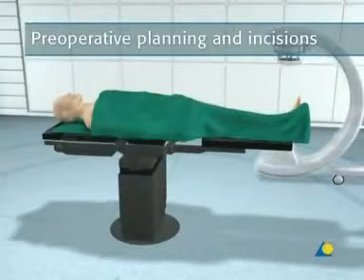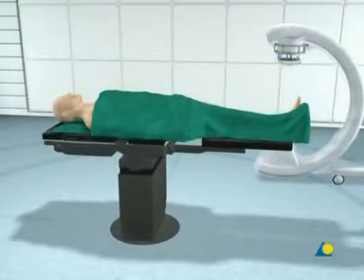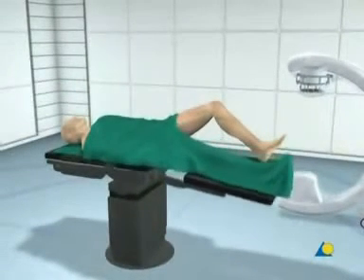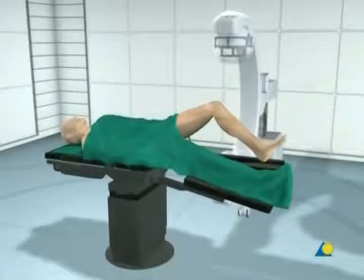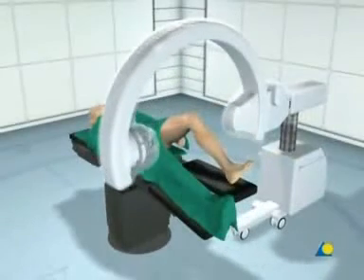Preoperative planning and incisions. The patient is positioned supine on the operating table with the injured knee flexed approximately 60 degrees. The uninjured leg is lowered so that C-arm images can be taken in both AP and lateral planes.